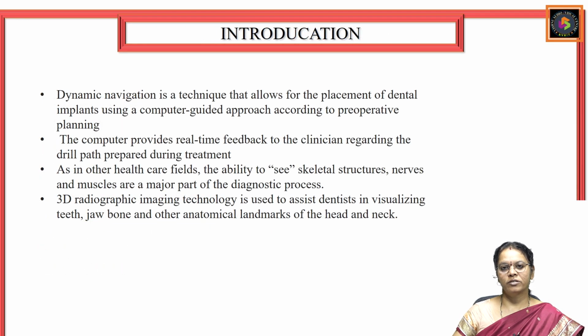Introduction. Dynamic navigation system is a technique that allows the placement of dental implants during the implantation surgery, and it will also help in pre-operative planning for the surgeons by providing a computer-aided imaging system called CBCT, that is cone beam computed tomography.